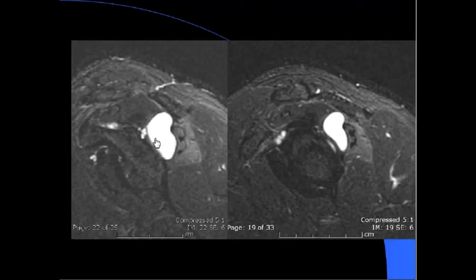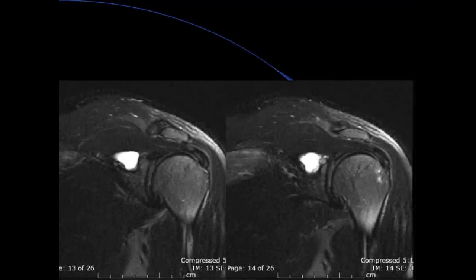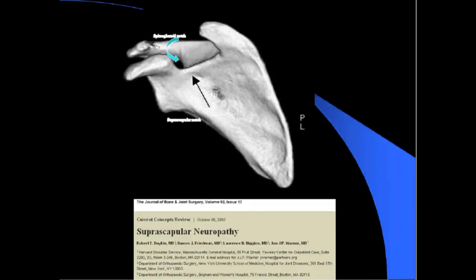Let's review the anatomy of the scapula. There are two notches: the spinoglenoid notch, where the spine attaches to the body posteriorly, and the suprascapular notch, which is the more anterior gentle concavity. What we saw was a large spinoglenoid notch cyst extending anteriorly, potentially coming into the suprascapular notch.